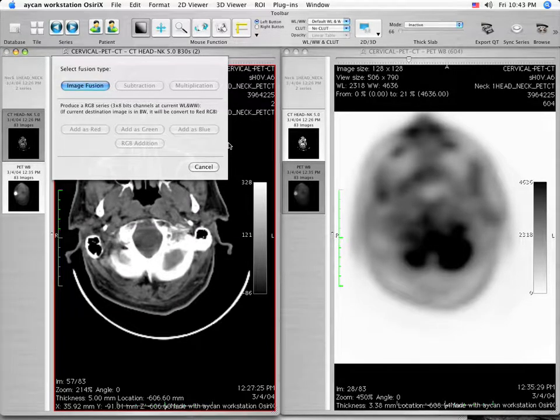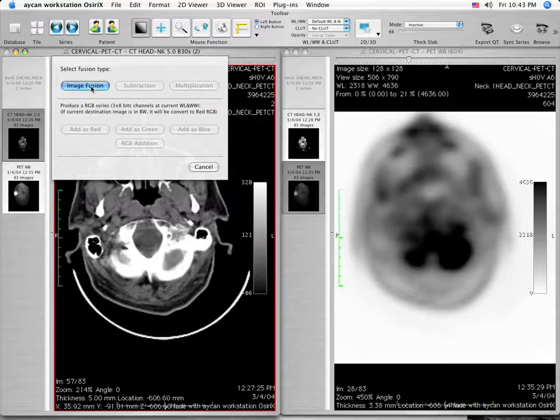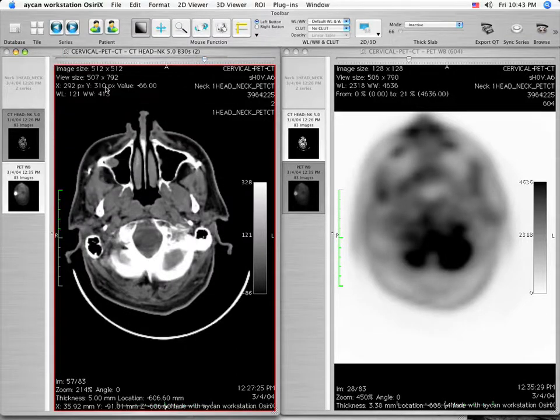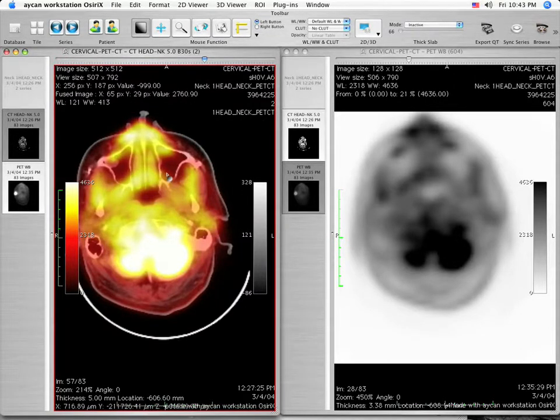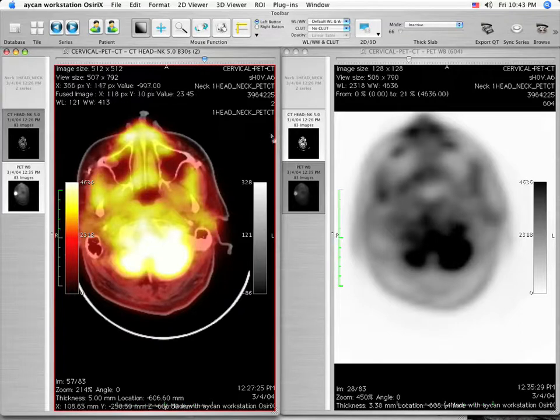A window appears asking you to select the function you wish to perform. Single left click on the Image Fusion button. The information from the PET series is now overlaid or fused with the CT series.